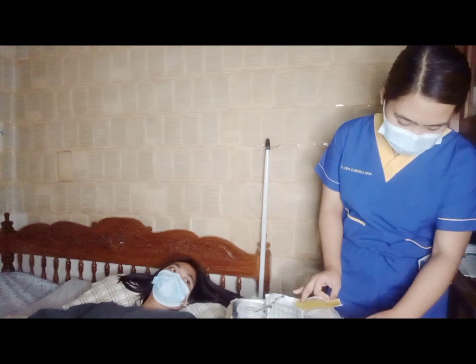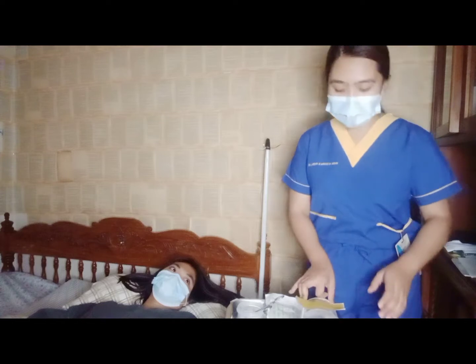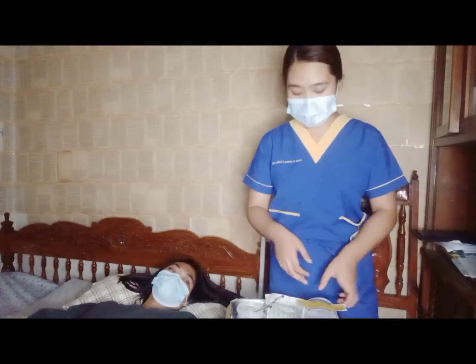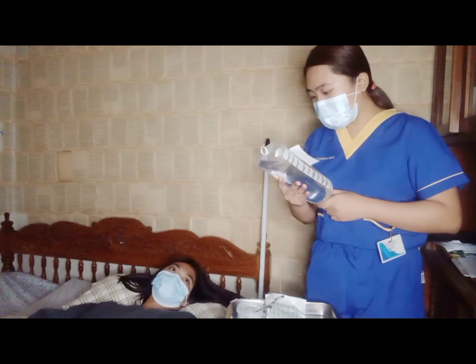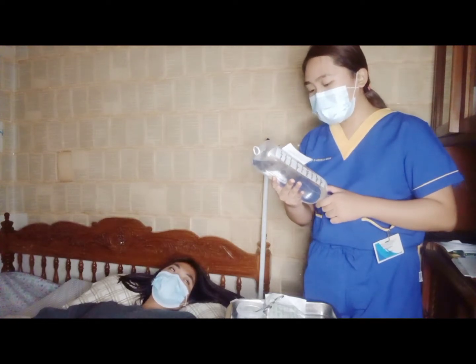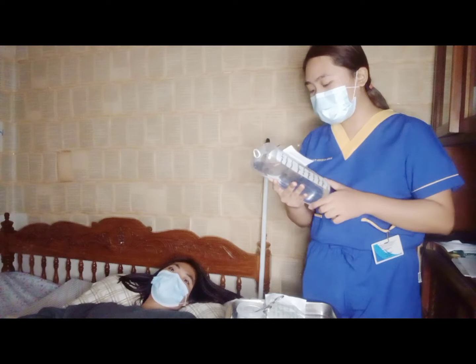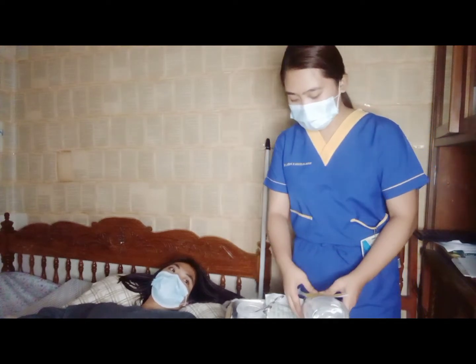The time strip allows a quick visual reference to check for the accuracy of the infusion. The label indicates the patient's name, date of administration, time, the initial of the nurse, time started, and also the drugs added to the solution.